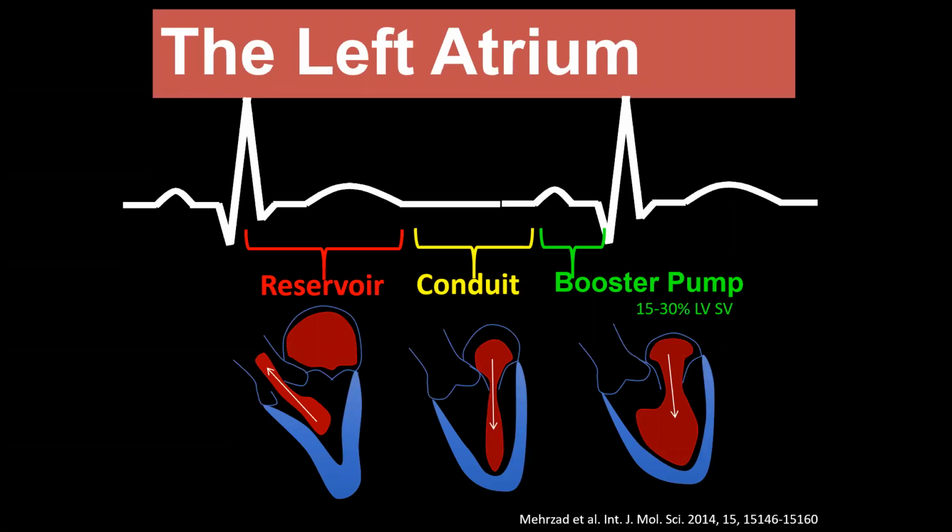Let's switch gears and talk about quantitation of the left atrium. And a lot of attention is being paid to quantitation of the left atrium lately. We understand more about left atrial physiology.